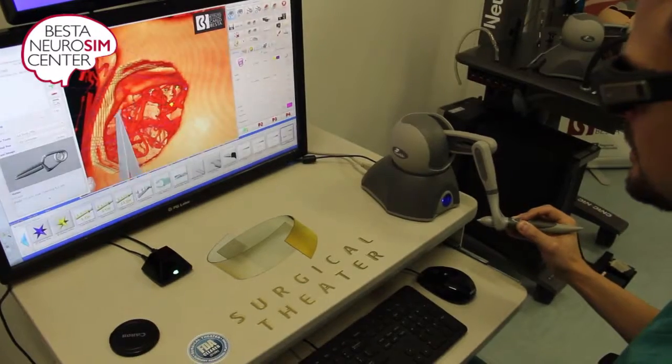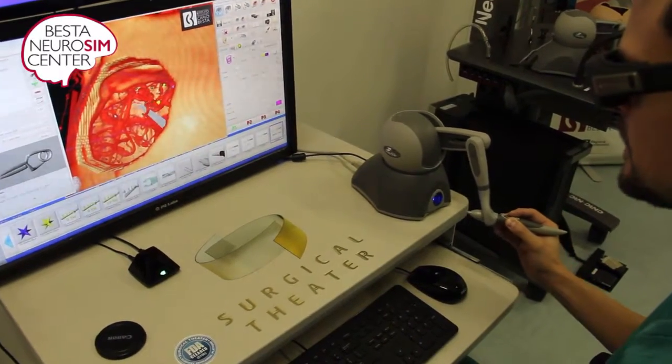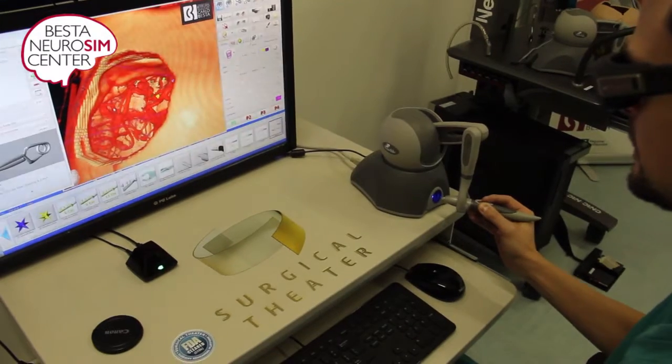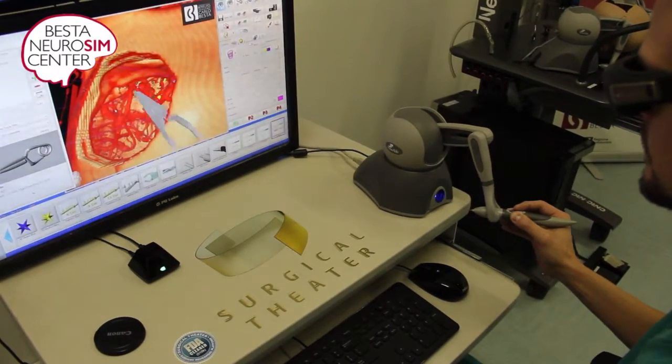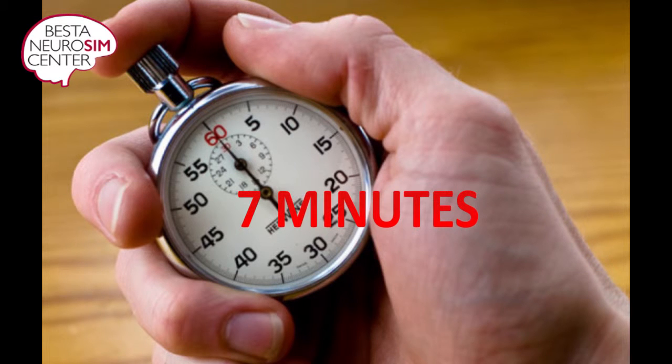You will have seven minutes to clip the aneurysm, trying to exclude completely the aneurysm neck and maintaining the patency of collateral arterial vessels. At this point surgery could be over, otherwise you may choose to reposition the same clip or change clip and replace it.